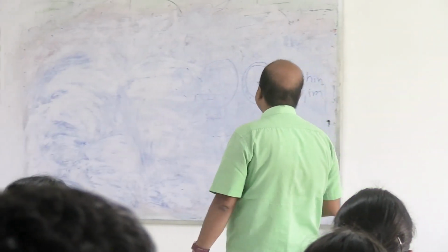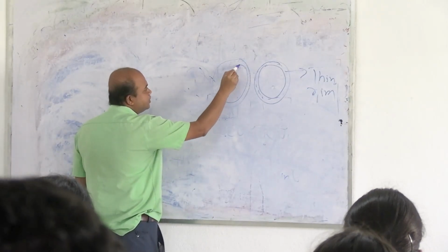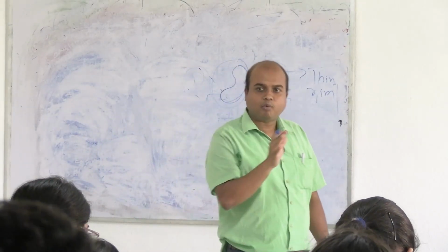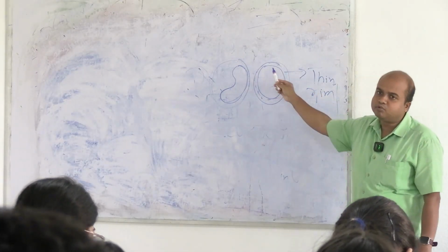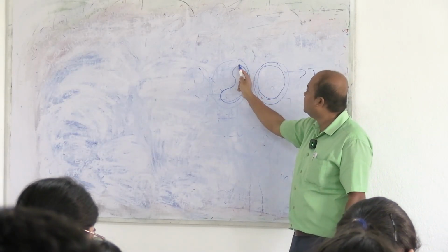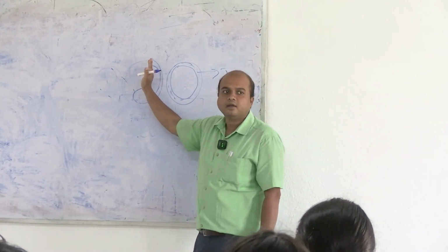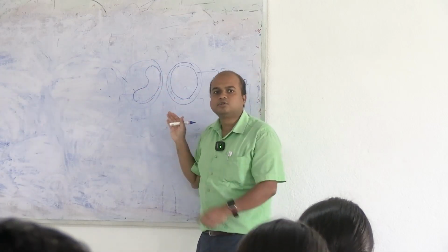Neutrophils are the most abundant among the WBCs. Okay, you have found a few lymphocytes, you have found eosinophils, then you will find among all those, monocytes are the largest ones, and again it is easy to identify because it has a typical shaped nucleus. This is called a bean shaped or kidney shaped nucleus, and this lies towards one end of the cell. Like in lymphocytes, it is just a thin rim of cytoplasm outside a round purple stained nucleus. In the monocytes, it is a bean shaped or kidney shaped nucleus, and an abundant cytoplasm in the other part of the cell, and the nucleus is towards one end.